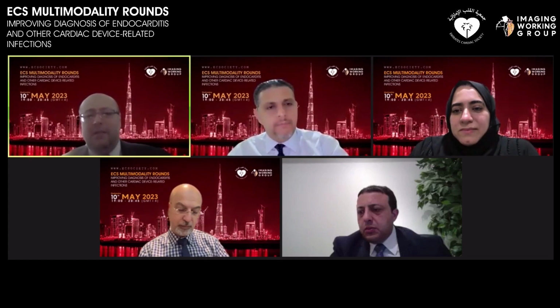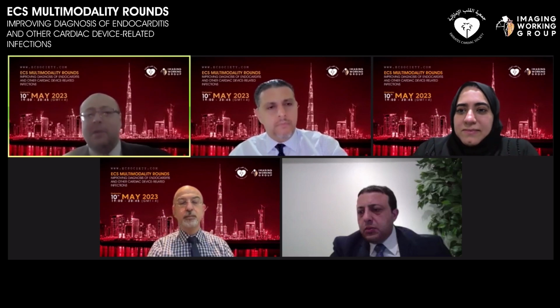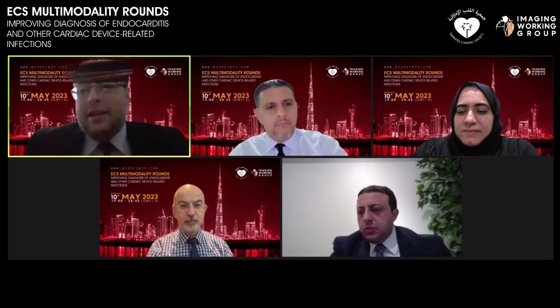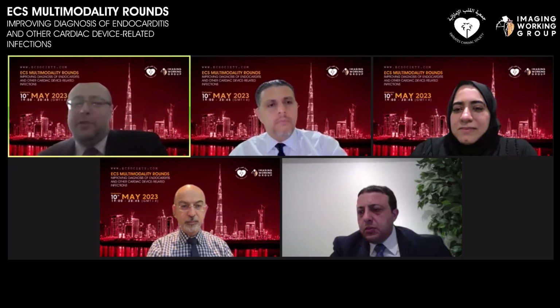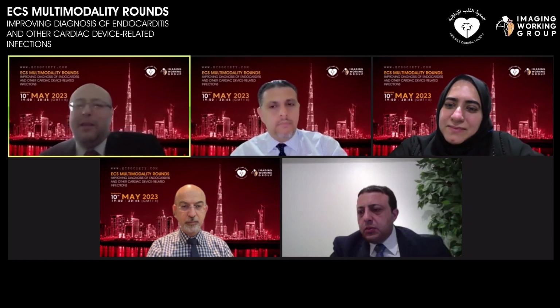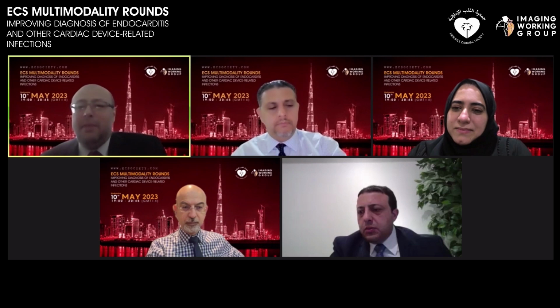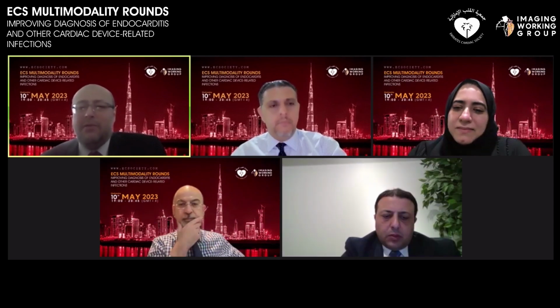As long as it's metal, theoretically. I may have had one case. The case that comes to my mind now, I had a left atrial appendage surgical clip, not a mitral clip, and it was extremely intense. I mean, this was very intense uptake. So anything metal, obviously, the more metal we put in the heart, the more chance that these get infected, and FDG PET is going to be very helpful for these patients. As long as it's metal, you should be able to see it. If it's native, you may not be able to see it. So left atrial appendage, theoretically mitral clip, you can see it. I don't have too many of these cases, just one case of infection in the mitral valve.